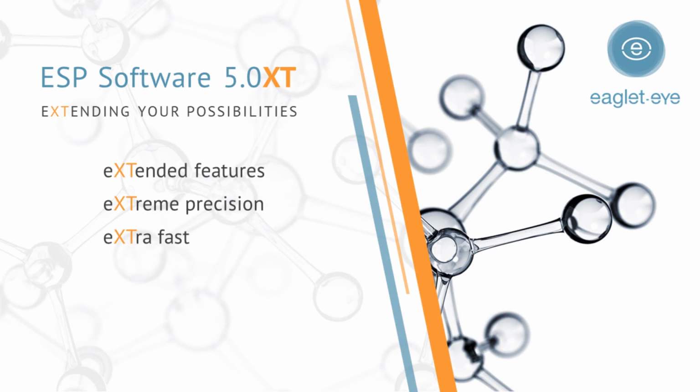So let me take you to the program. We'll start with 5.0 XT, dig in deeper, and drill down into the new features. At a certain point in this presentation, or this webinar, this user forum, we'll switch over to introduce to you our new professional ambassador. Unfortunately, he has a very busy day today, so he will join us at a certain moment, and at that time we'll dynamically switch to introduce him. And Rainier, on the basis of questions we received in the previous weeks, has put together some case examples where he will explain to the whole group what the answers are to these questions, and do a bit of coaching and internal training.